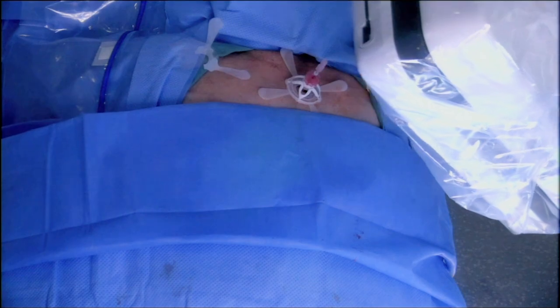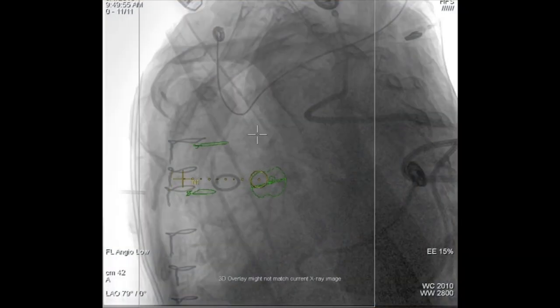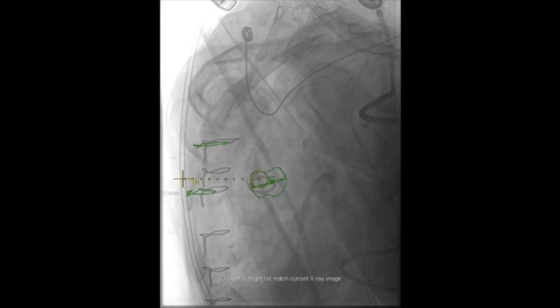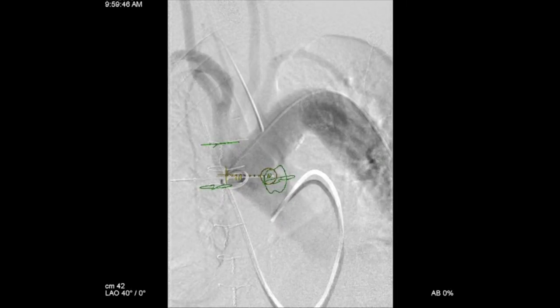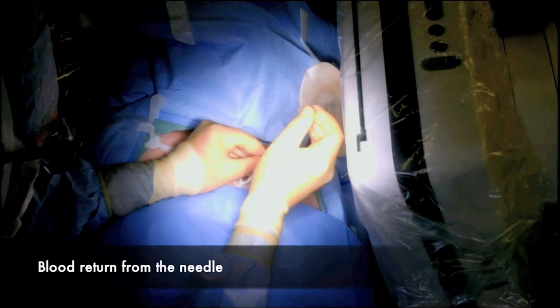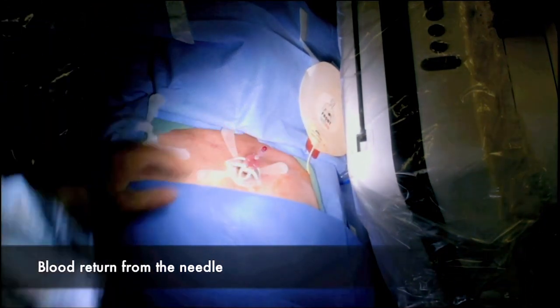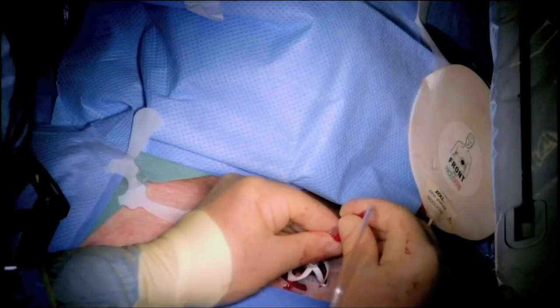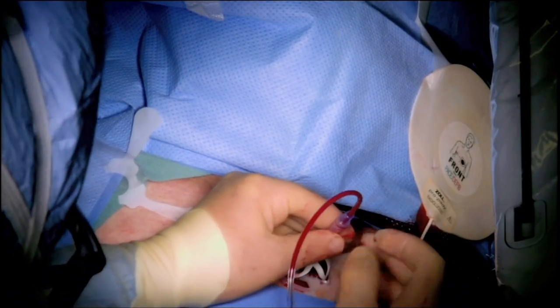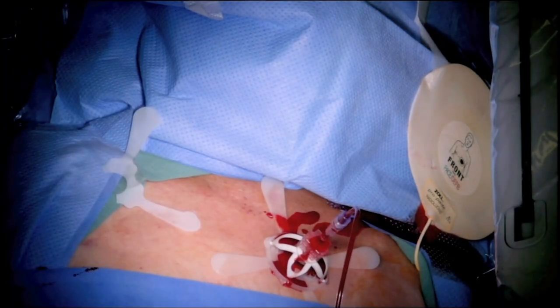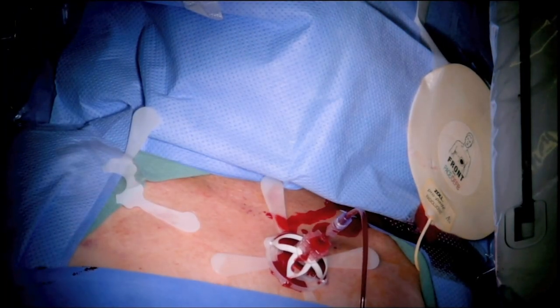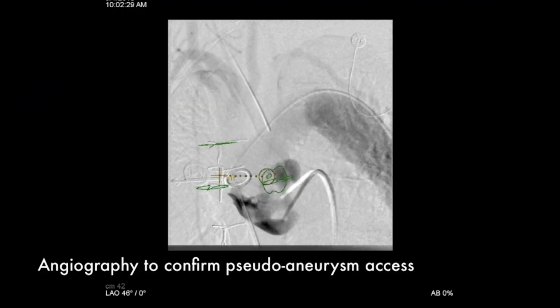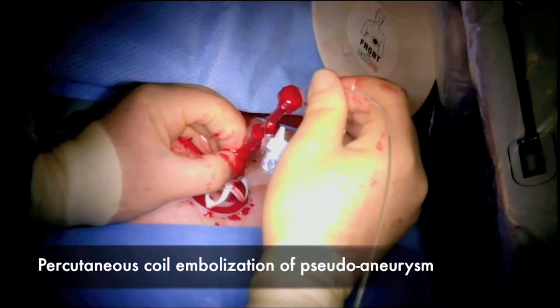We check the position to see where we are in relation to the pseudoaneurysm. The yellow lines represent the needle guidance track. Here the needle is straight inside the pseudoaneurysm, with position confirmed by injecting into it. We first confirmed blood return, which could only be coming from the aorta or the pseudoaneurysm, and then performed an on-table angiogram by directly injecting into the needle. You can see we opacify the pseudoaneurysm, which then forms a track through the hematoma.